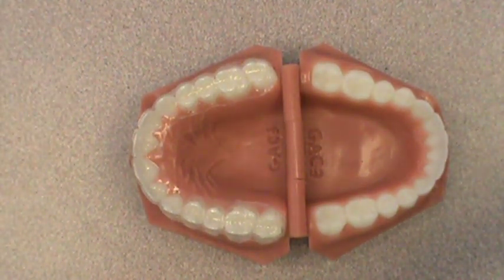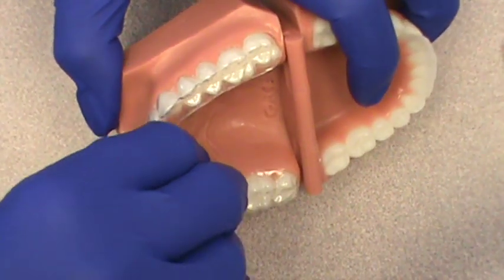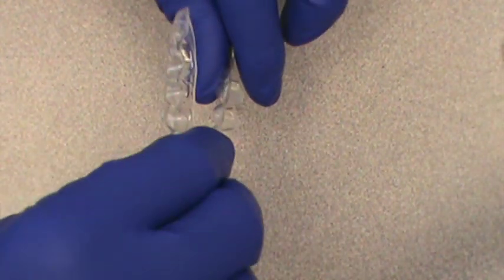The other type of retainer that's also very popular is called the Essex type of retainer, and these are clear retainers. They require some special care because they're fairly thin plastic.